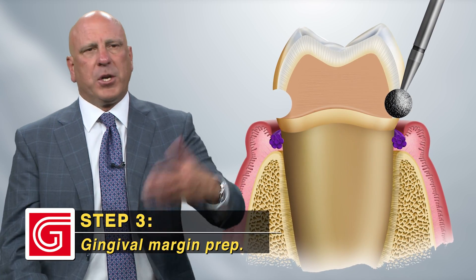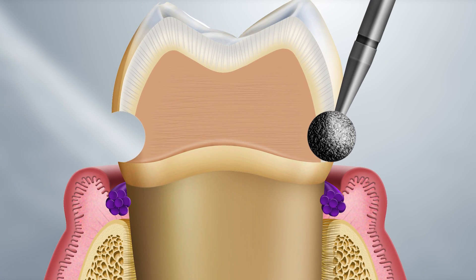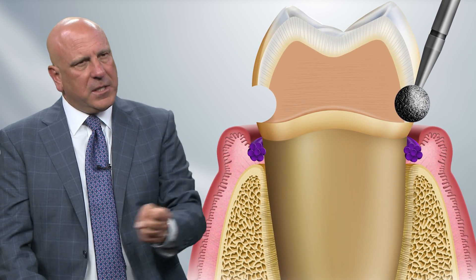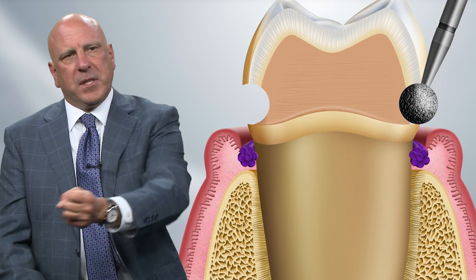Then we're going to do our margination. We'll take our 801 burr — let's say a 016 if we're doing a zirconia crown — and trace it from the mesial facial line angle to the distal facial line angle, then the same on the lingual side from the mesial lingual to the distal lingual. Sometimes with these smaller round burrs, the 014 and 016, they'll actually fit in between the teeth right where you made your #56 burr cuts. If there's room, feel free to go all the way through there.